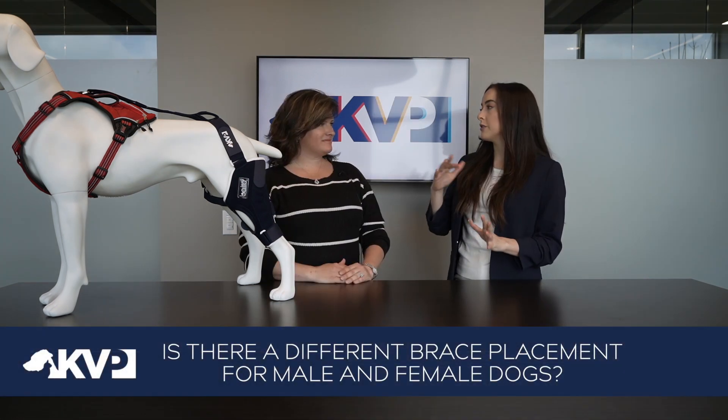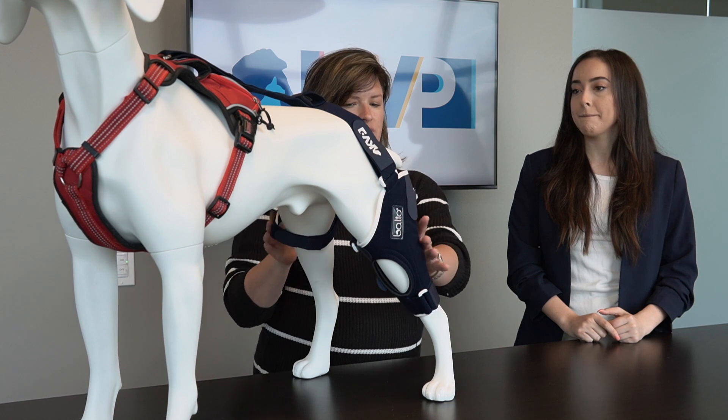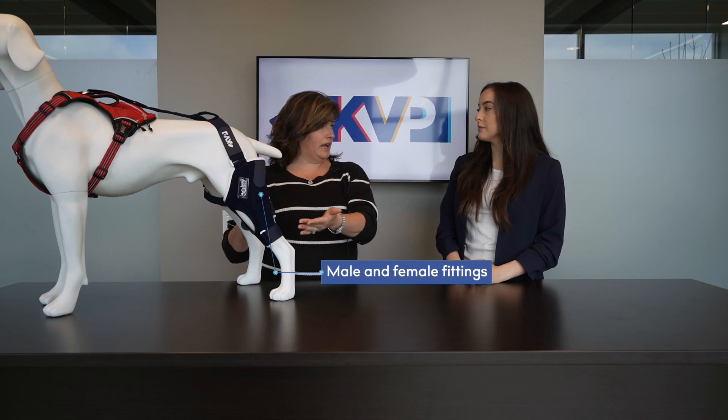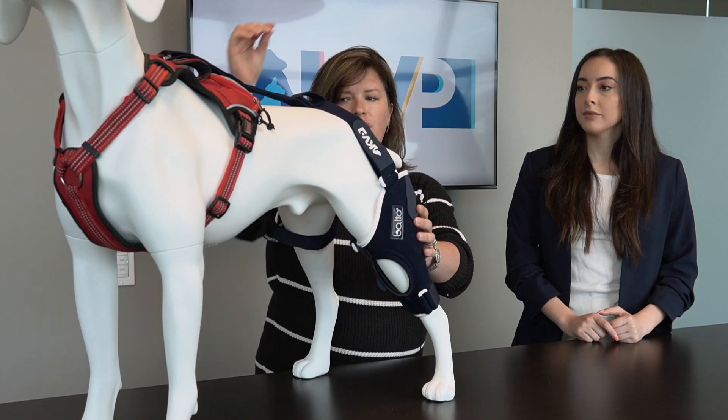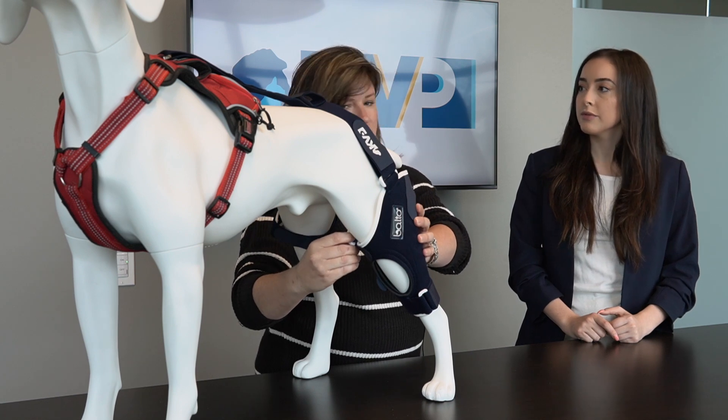So Vonda, is there a different placement of the brace that you would do for a female dog rather than a male dog? Yeah, so depending on their anatomy and the way that we're going to anchor this — this is on this patient for male anatomy with the anchor brace on the opposite leg — for female anatomy, it is sometimes easier and a lot more stable if you take this strap that's on the lateral side here, wrap all the way around the belly, and it's actually going to attach to the medial side of this brace. Just make sure you come in front of the opposite leg and then still use the anchor strap to the harness for increased stability.